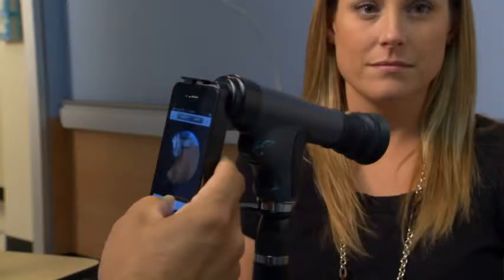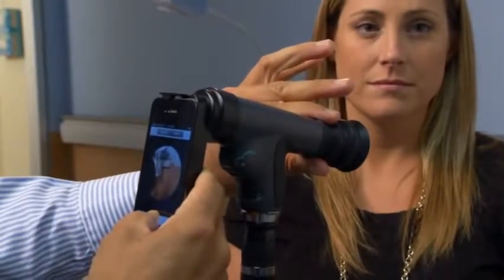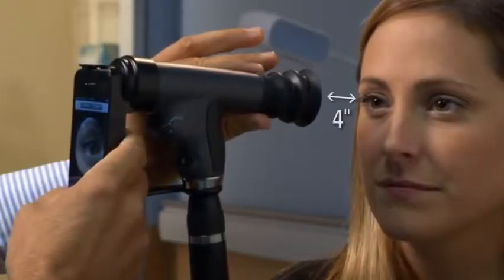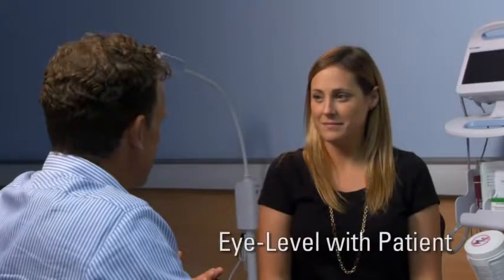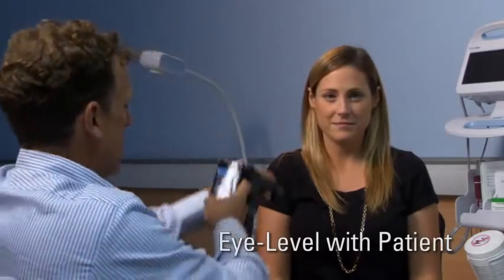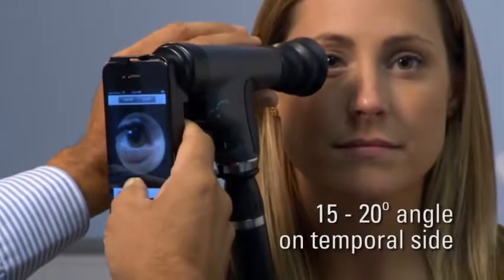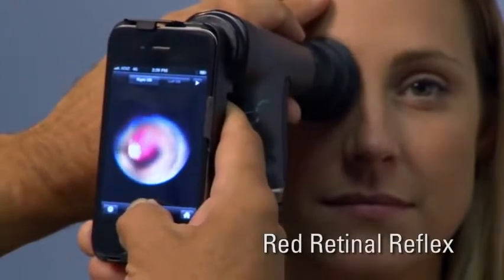With your left hand, grasp the end of the scope nearest the patient eye cup between your thumb and index finger. Sit opposite the patient and hold the PanOptic approximately 4 inches away from the patient. Position yourself at eye level with the patient and instruct the patient to look over your shoulder at something on the back wall. Direct the illumination into the patient's eye at a 15 to 20 degree angle on the temporal side. Find the patient's red retinal reflex on the screen.